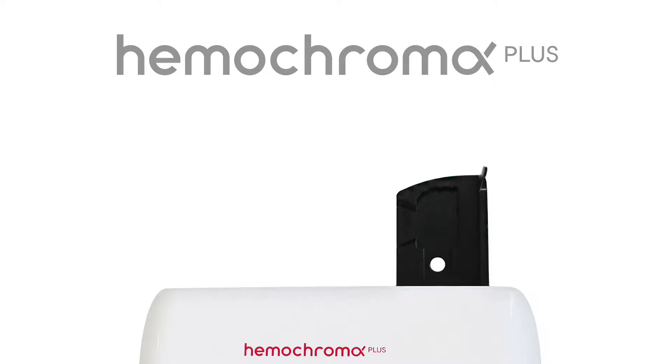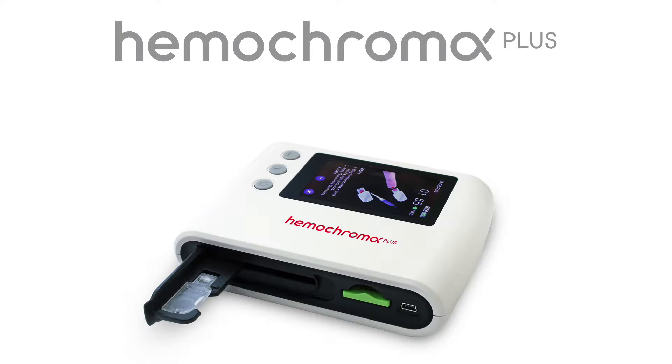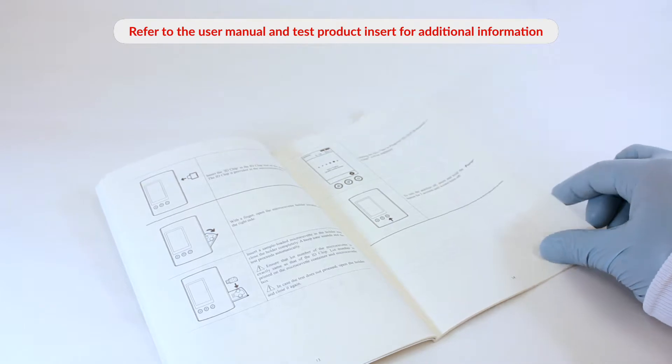Welcome to the Hemochroma Plus Analyzer instruction video. This training video will show you how to use the Hemochroma Plus Analyzer, a point-of-care analyzer for hemoglobin testing. Refer to the user manual and test product insert for additional information before testing for the first time.